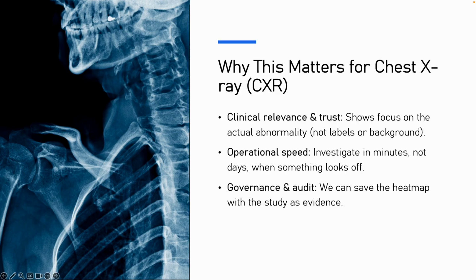Why does this matter to us as a CXR program? Seeing the bright area on the true finding builds confidence. When a result looks odd, we can tell right away if the model looked in the right place, which speeds follow up. And we store the explanation with the case so QA and auditors have a clear record. Net effect: better trust, faster workflows, stronger compliance.